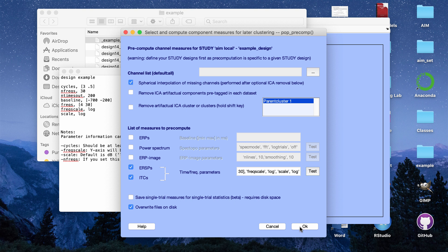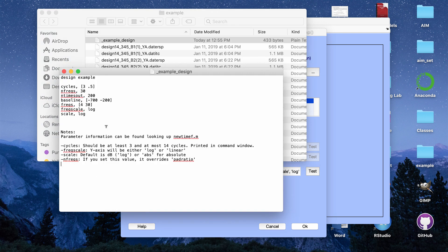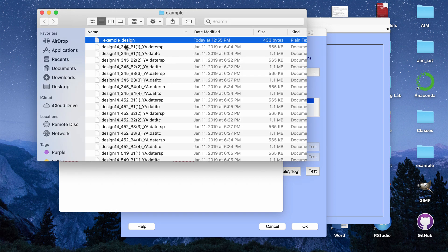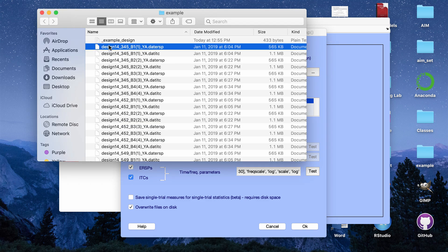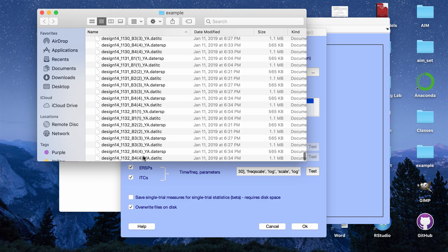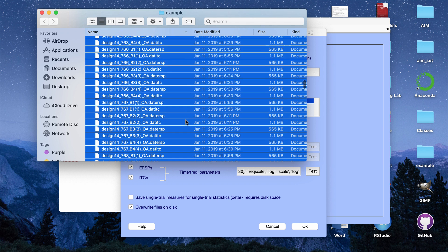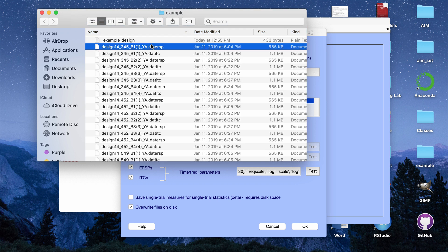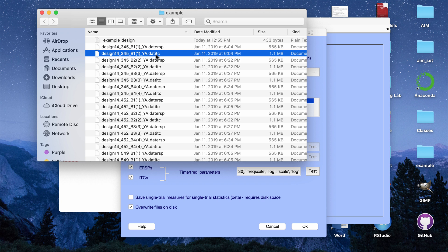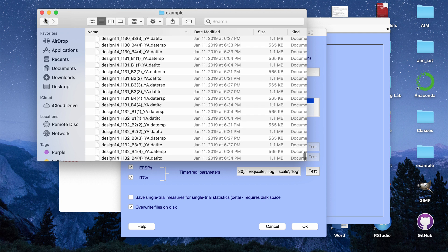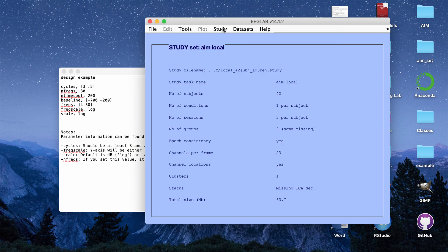If you click OK, MATLAB will start running and creating the ERSPs and intertrial coherences. I already ran this with this exact setup, so I'm not going to run it again. What it will produce are files in the folder you specified in your study design — for each subject and condition pairing, it creates a .ERSP and a .ITC file. Once that's done, you can plot your time frequency plots.